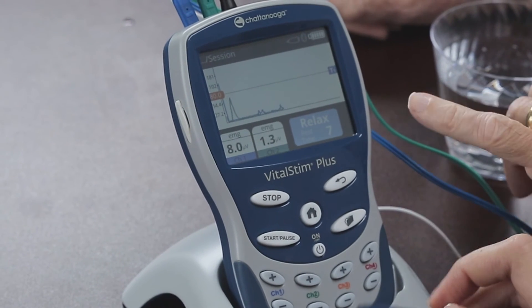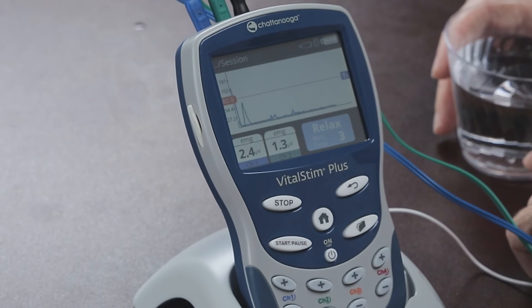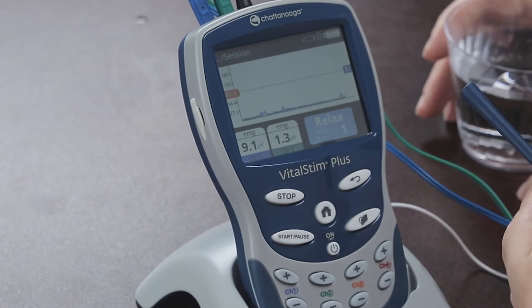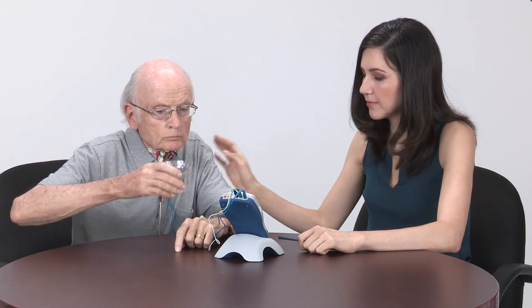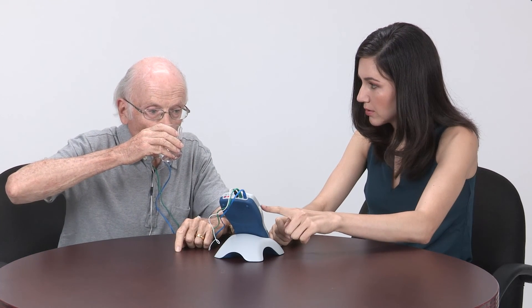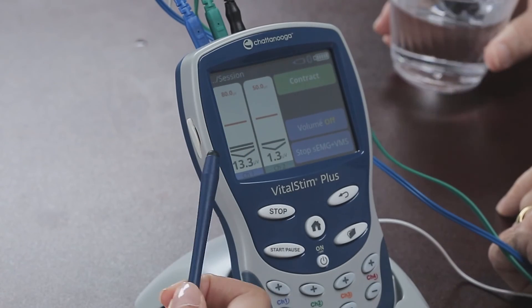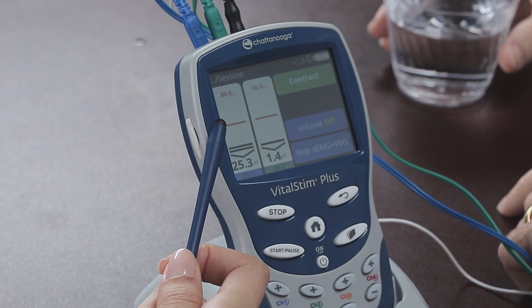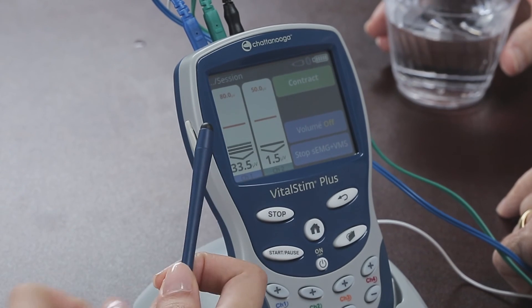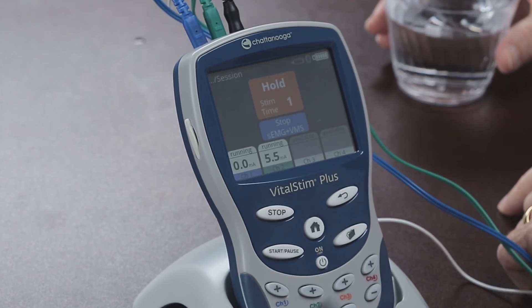In relax mode, instructions will be provided to the patient: get ready, you're going to be asked to swallow. When you get the swallow going, try to put in a big effort to reach the threshold. When you reach the threshold, hold it for the required amount of time. Once this is done and executed, the patient repeats this cycle as many times as is therapeutic. And this concludes this video tutorial.